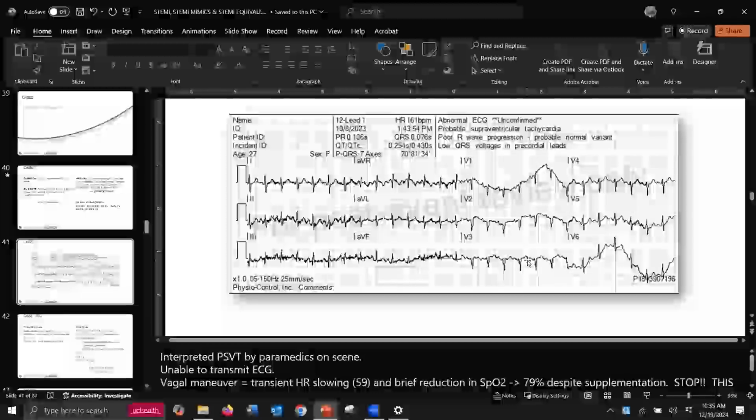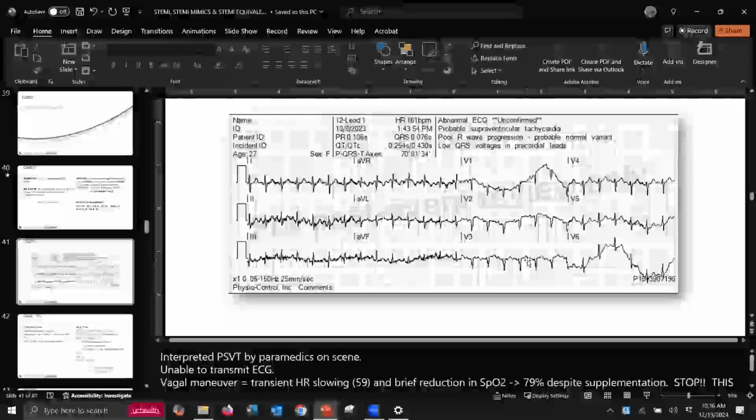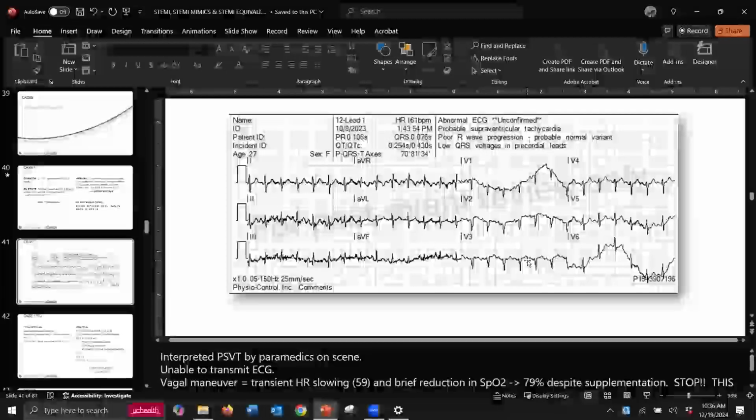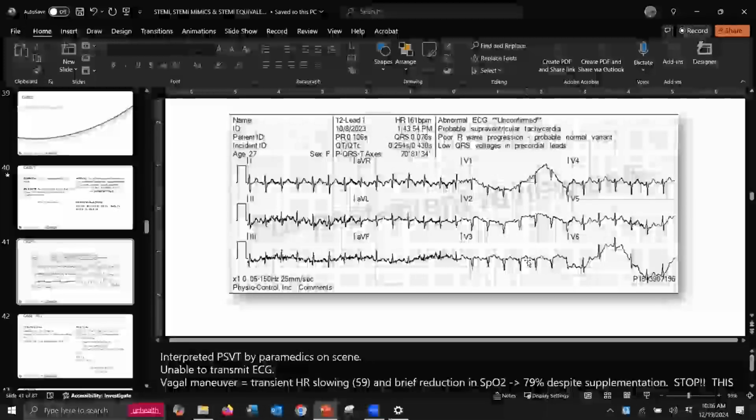Well, when we look at something and we say it's tachycardic, tachycardia is the thinking man's dysrhythmia, right? What do we do to compensate for cardiac output? What's the initial thing that our heart does? It speeds up, right? In order to preserve cardiac output, we increase our rate. Think of tachycardias as being compensatory for something. Do you have to act right now? What was her initial blood pressure? 125/99.